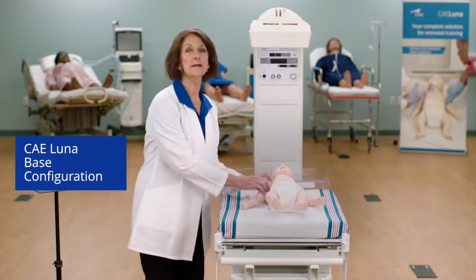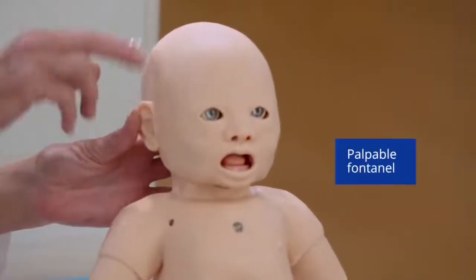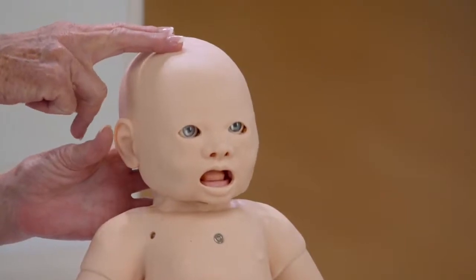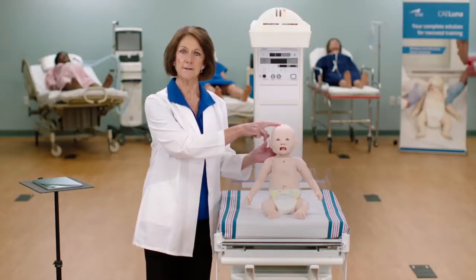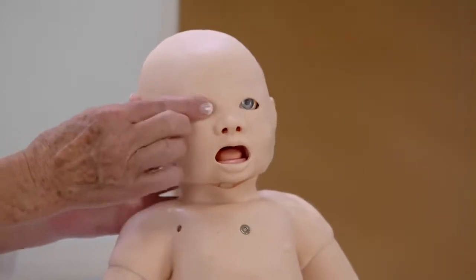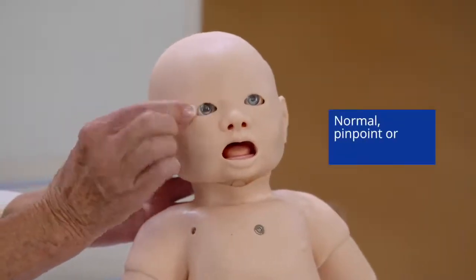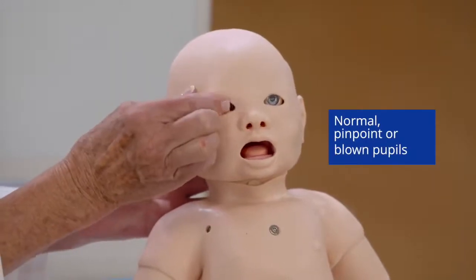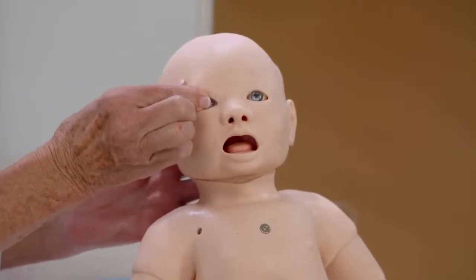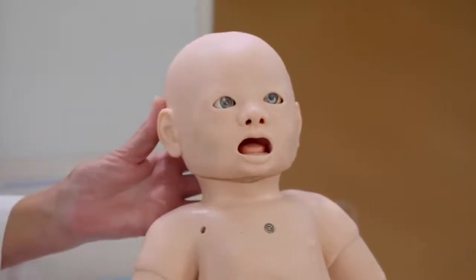Luna base configuration offers a palpable anterior fontanelle which can be set to various degrees of bulging, neutral, and sunken. Luna offers tri-state eyes with normal, pinpoint, and blown pupils, which can be changed by manually rotating in a lateral movement.